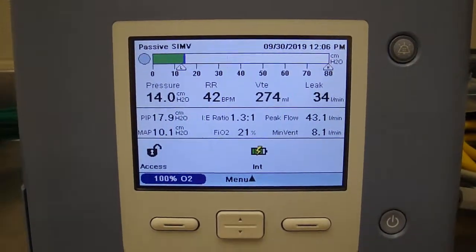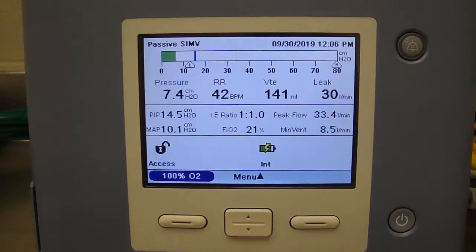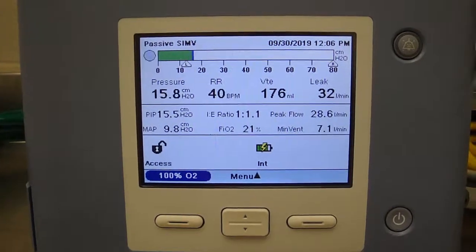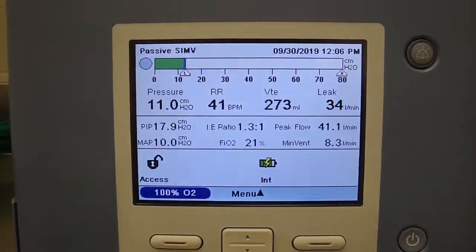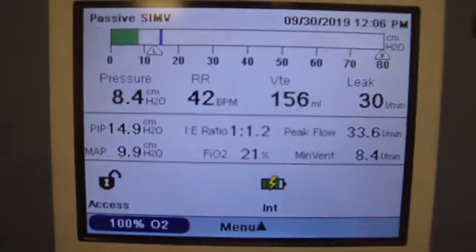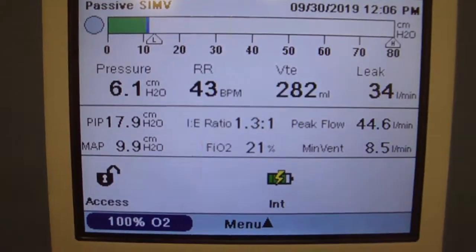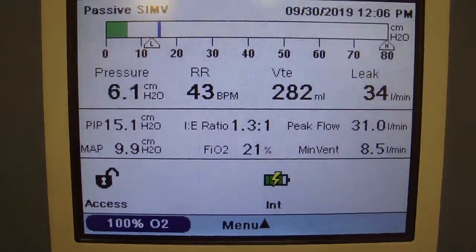This is the Trilogy 202 ventilator that you may see in your clinical area. I'm going to zoom in here for the screen. This is the regular screen that you'll primarily see.